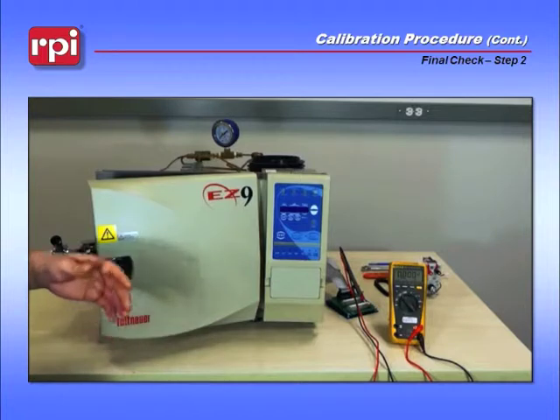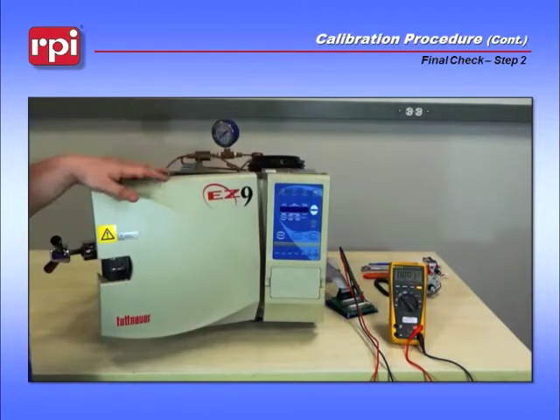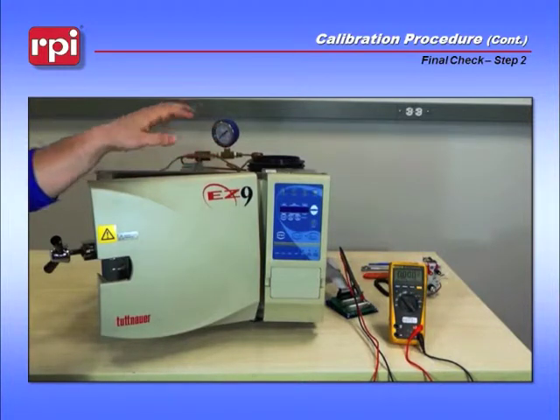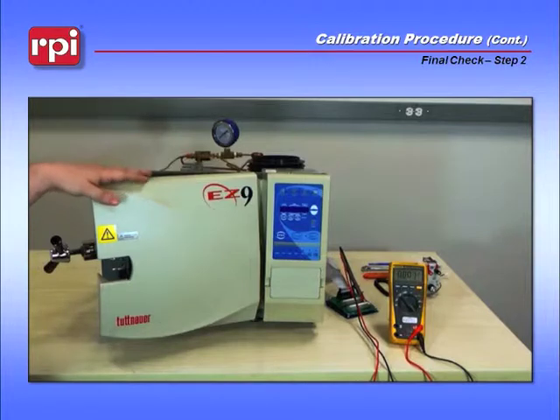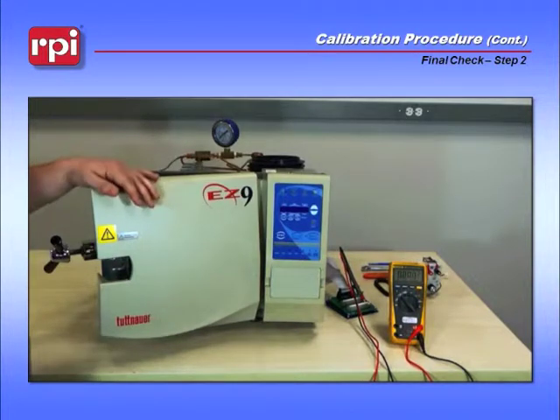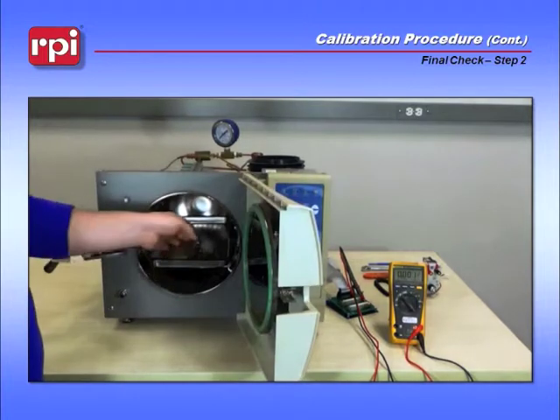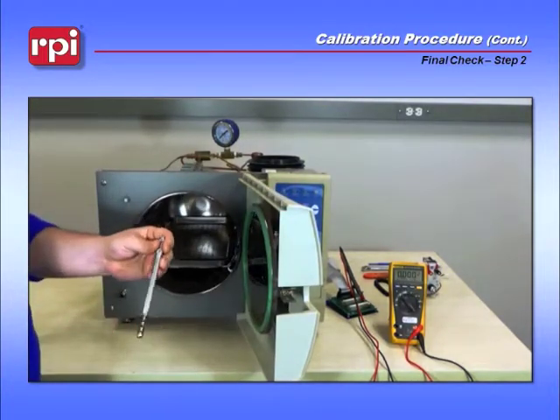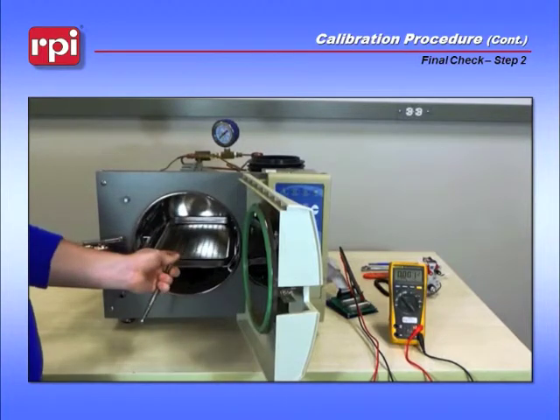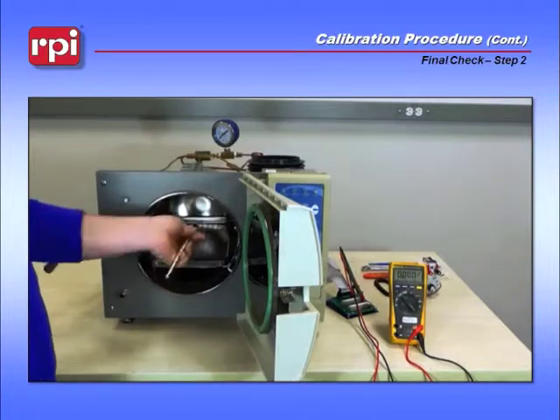The final check will be completed by running an unwrapped cycle. If you'd like to run a pack cycle to verify drying is still functioning, go ahead and do that, but for this test we'll be running an unwrapped. Before you begin, open up your door and double check that you have the RPT-113 max register thermometer placed inside the chamber on a tray. Be sure that it is shaken down so that the thermometer reads 150 degrees.